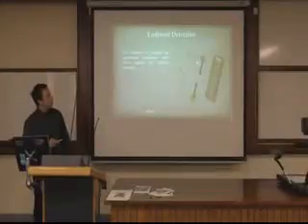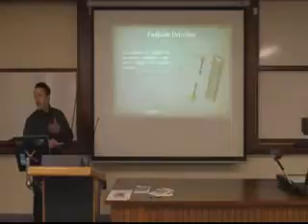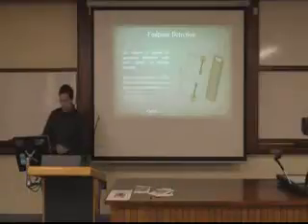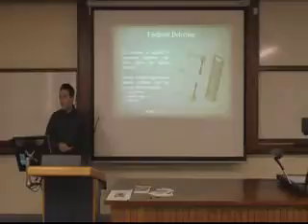It can assign it an orientation, so it says that, hey, I was an endpoint here, and the fiducial marker was lying approximately this way. It's a quantized angle, it's not very accurate, and it doesn't need to be at this point in time. So, detected endpoints must possess qualities consistent with the geometry of the fiducial, so they must have approximately opposite angles, separation distance, ds, and also the pixel label, so they must belong to the same component.